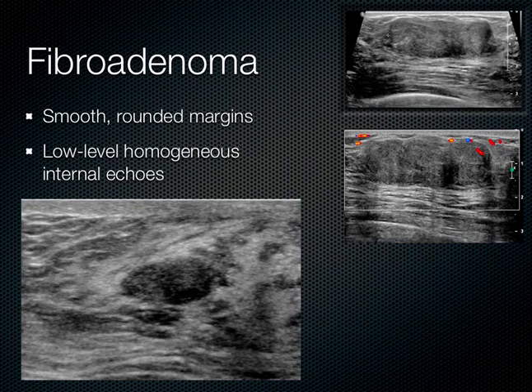Now, this is an example, several examples here of fibroadenoma. It's a well-circumscribed ovoid mass. Maybe just very subtle posterior acoustic enhancement over here. I kind of see it.